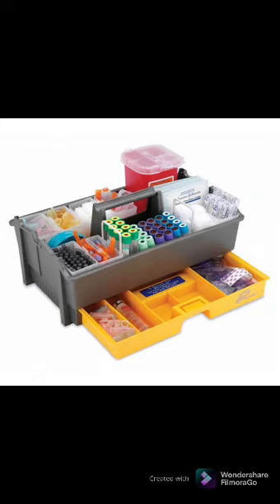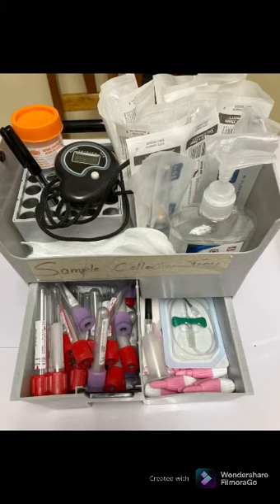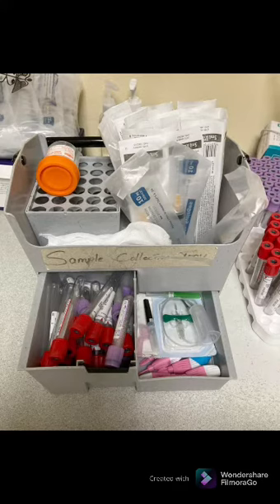Components of a phlebotomy tray: alcohol swab, gauze, assorted evacuated tubes, syringes, syringe transfer device, butterfly collection set, micro collection equipment, tourniquet, disposable gloves, sharps container, pen, and watch.